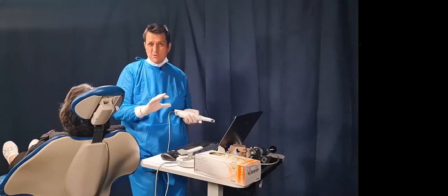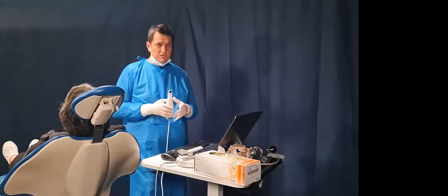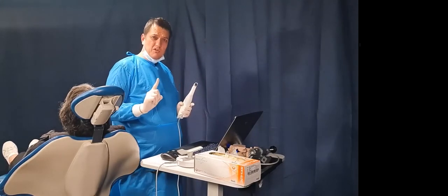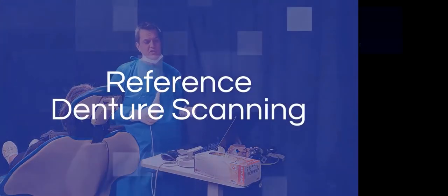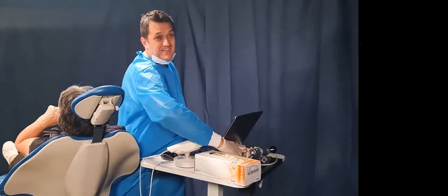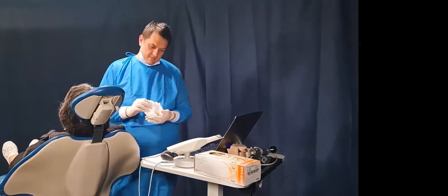We'll talk about mucocompressive and static a little bit later in our debrief, probably Joe and I. Joe, we can talk about that. But that's our nuts and bolts scan. I want to show you now the reference denture technique. Now I've got our poor patient's denture here, and I've done a PVS before we went on air this evening.